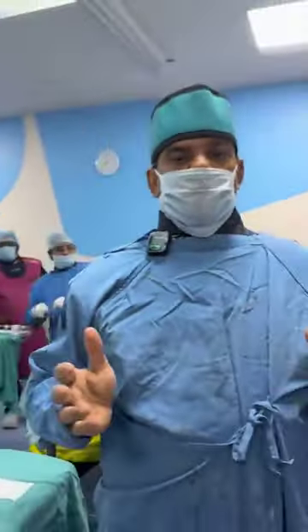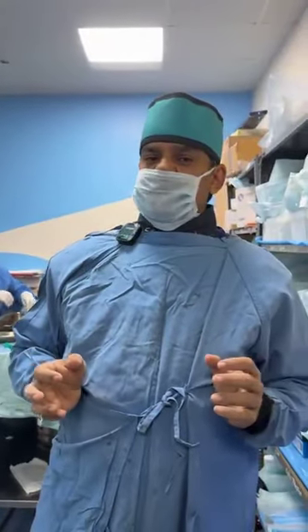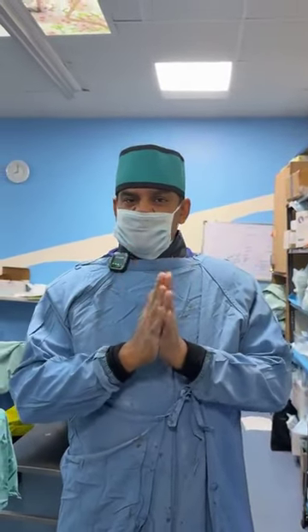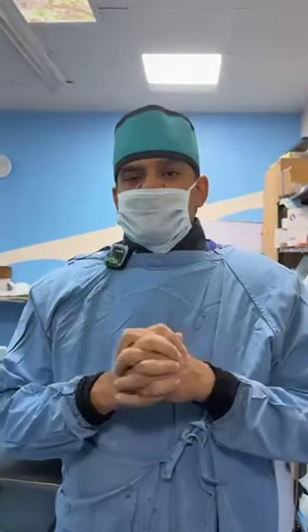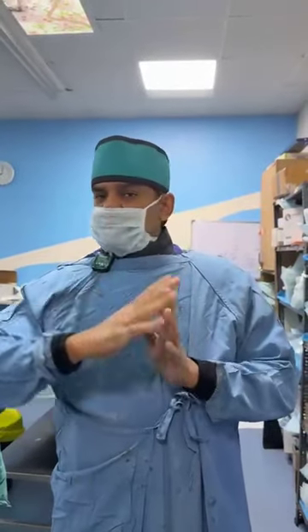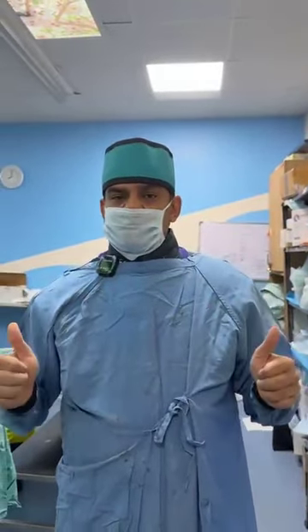So, thank you so much for joining us for this interesting dissection case this evening. It was a type B aortic dissection. The dissection was just coming at the level of the left subclavian artery, and we have seen that both carotids are coming out the same, that's a bovine arch. We went from the true lumen to true lumen, and then we grafted, and everything looks so beautiful.